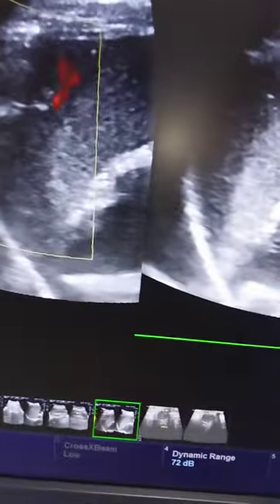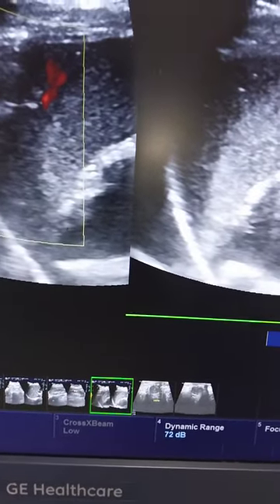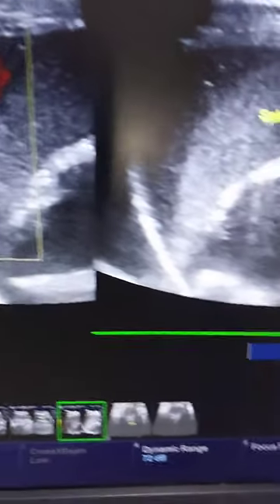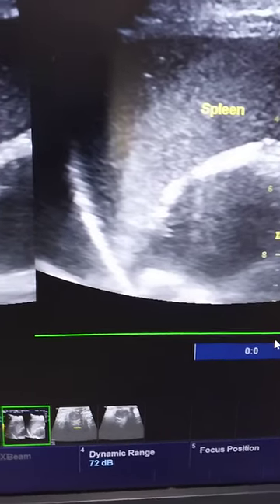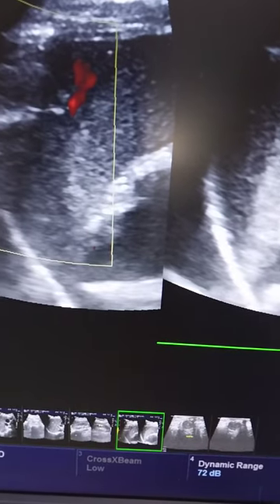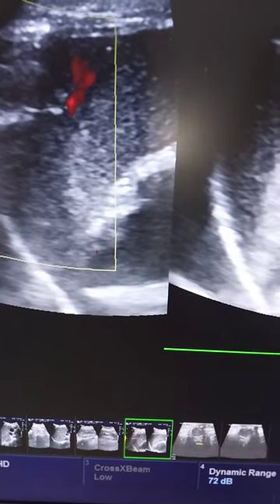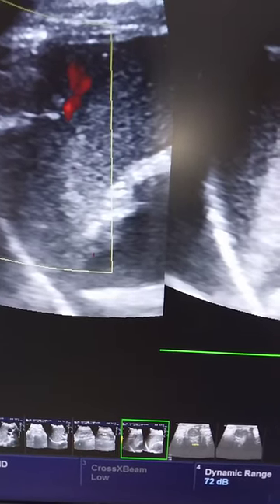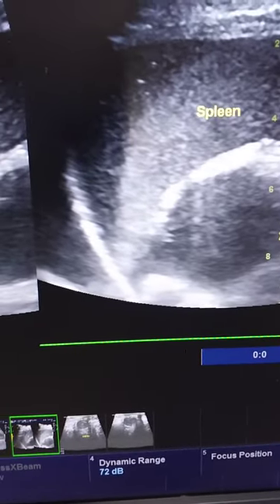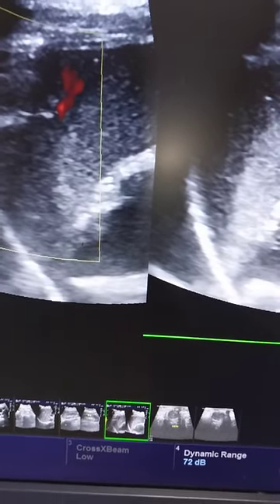Today I am going to share with you a very interesting case. An old lady came with no major complaints. As you can see, this is the spleen and anterior to it you can see the beaver tail of the liver with vascular channels. You can clearly see vascular flow in the beaver tail of the liver. So you can see the spleen and the beaver tail of the liver.